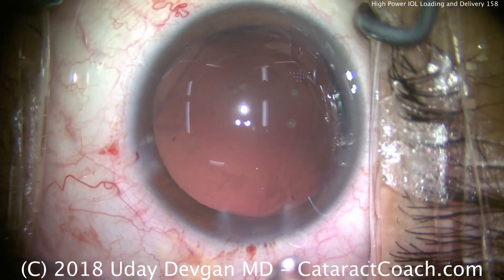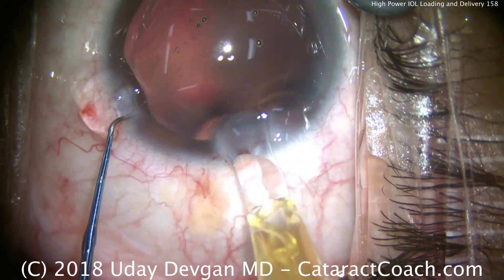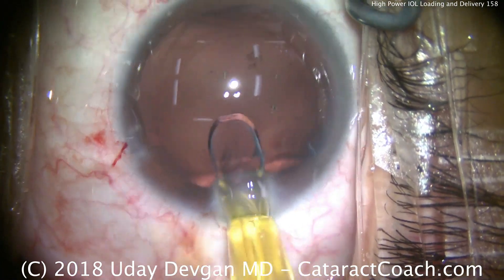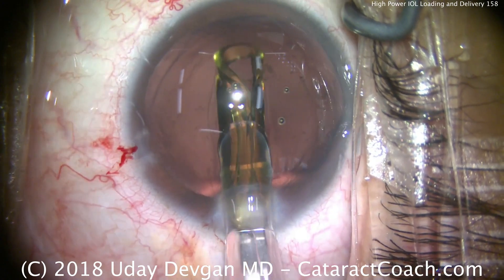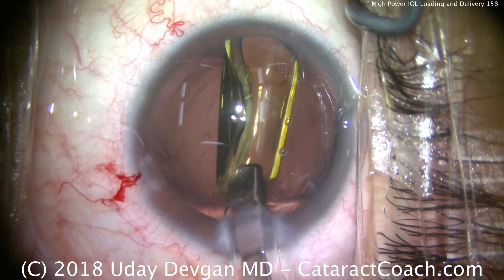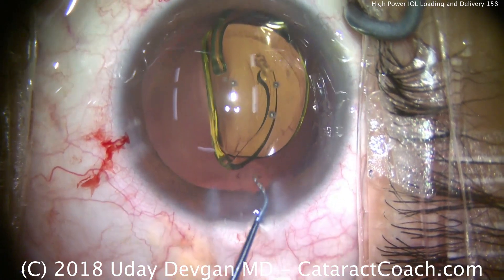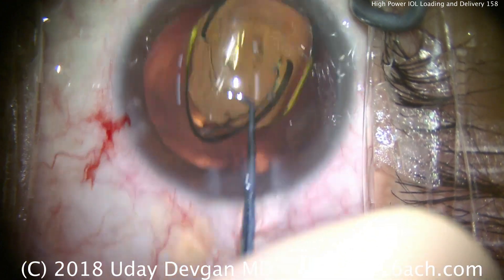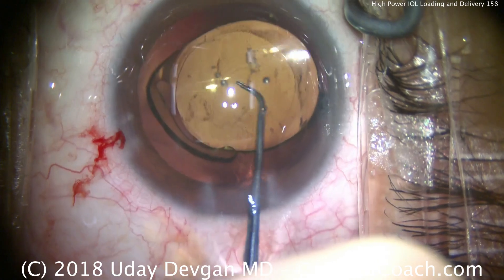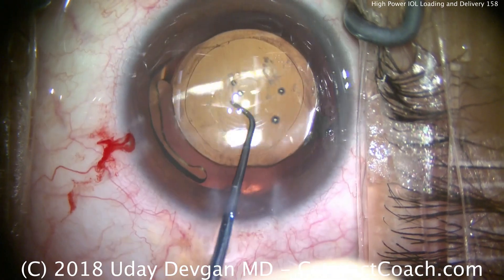We're going to fixate the eye with the chopper again — that's important because this cartridge is barely going to fit in the incision. There's the tip going in. As you advance it, if you feel resistance, stop. That means you don't have enough viscoelastic lubrication in the cartridge or the cartridge is too small. Using too small a cartridge will damage or crack the IOL optic. It's always better to enlarge the incision and use a bigger cartridge tip than to force it through a small one.